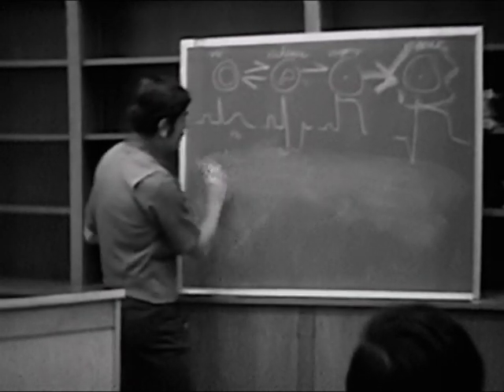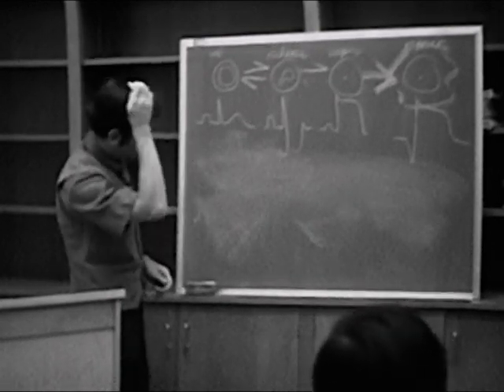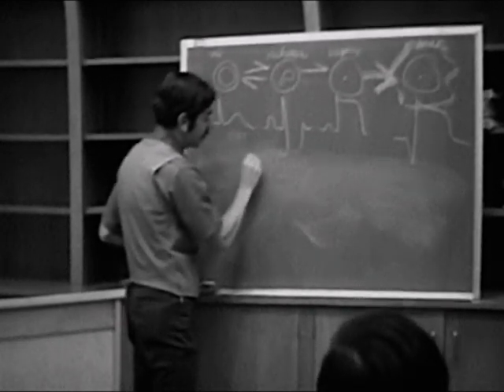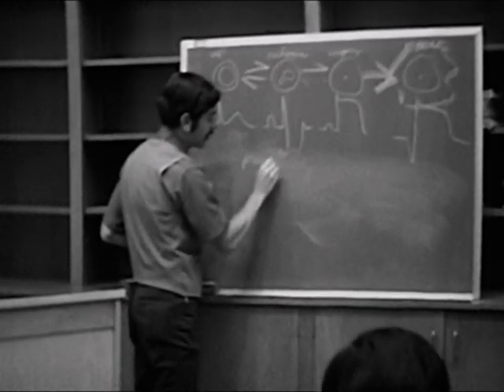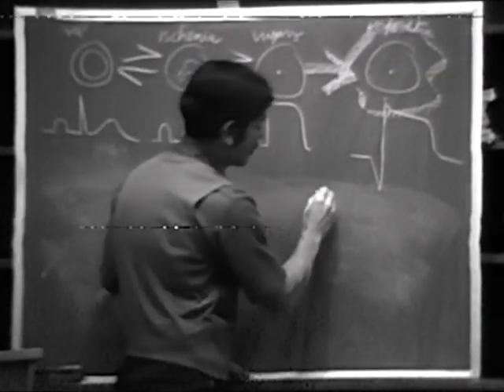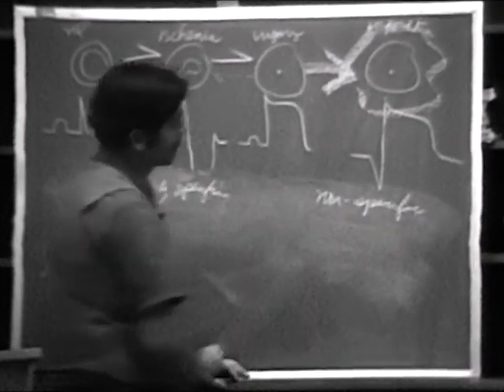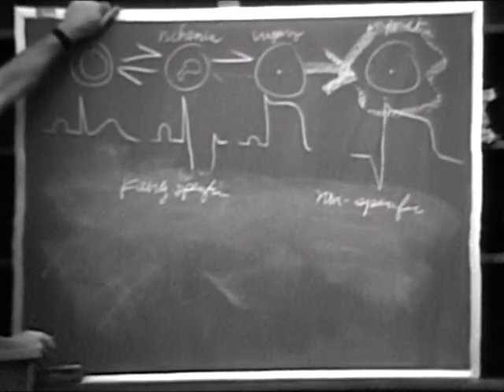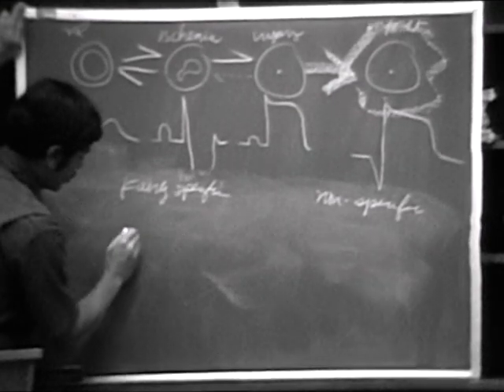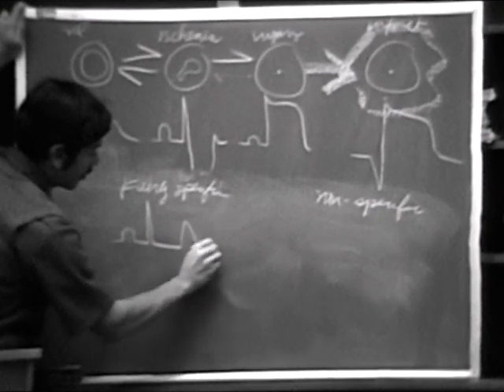All right, now, the electrocardiogram and ischemia. We have several kinds of changes. One type which I like to call the fairly specific changes. Fairly specific. And then we have non-specific. Okay, now the fairly specific, probably in its most subtle form, would look something like this.